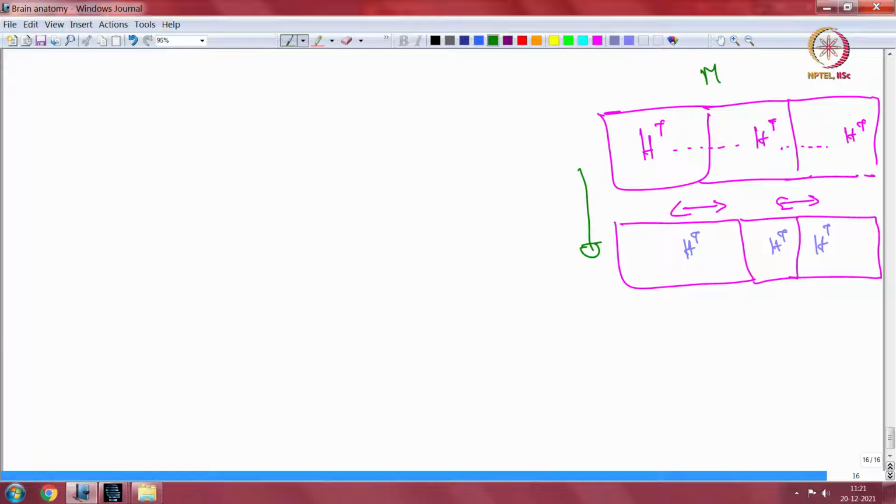The logic is you stop motion, which is why, I do not know how many of you have actually undergone an MR, the instructions given are that you have to remain perfectly still. Perfectly still for how long?